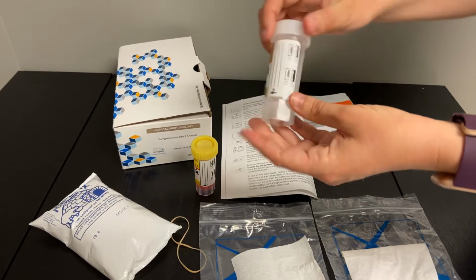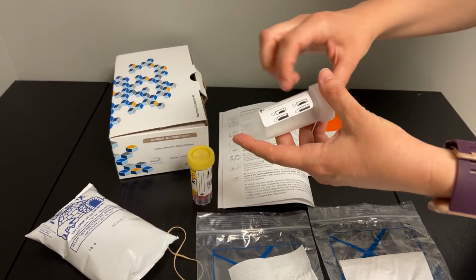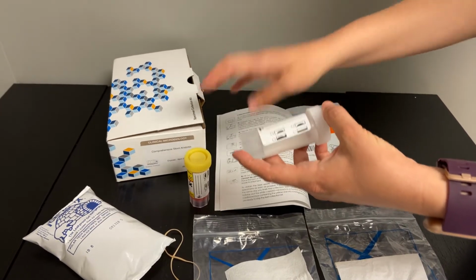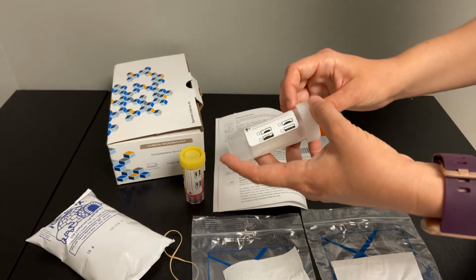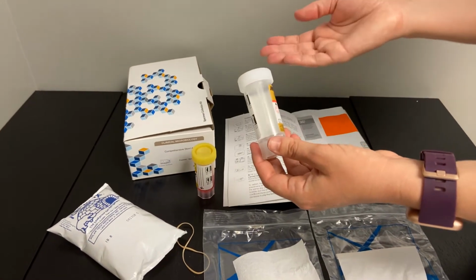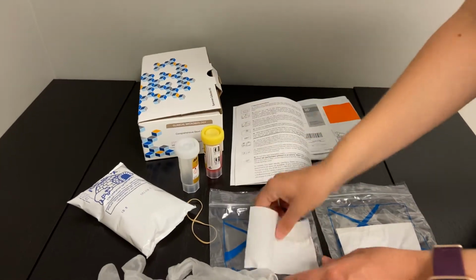You'll twist this cap on, label with your name, date of birth, date and time collected, as well as what the consistency was. Same legend, same thing as what we had with this one here. So more formed versus more liquid. You do not need to shake it because there's nothing in there to mix. You'll then make sure both these ones are nice and twisted on tight.